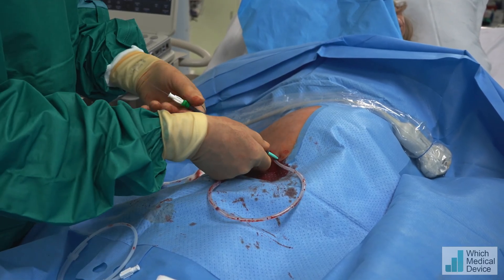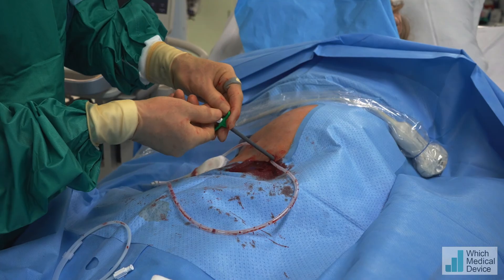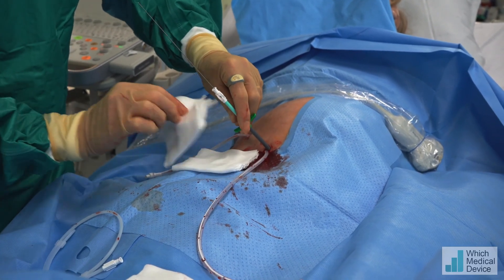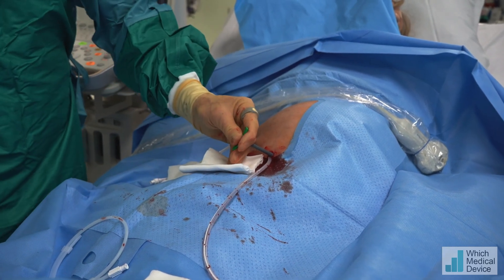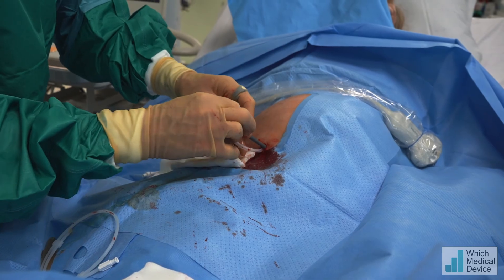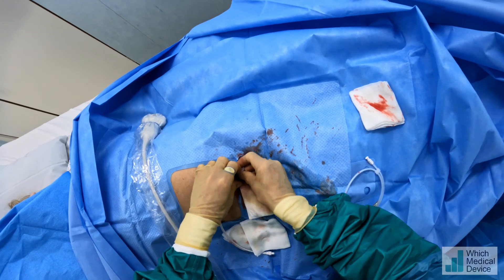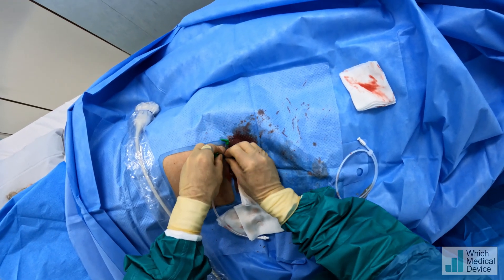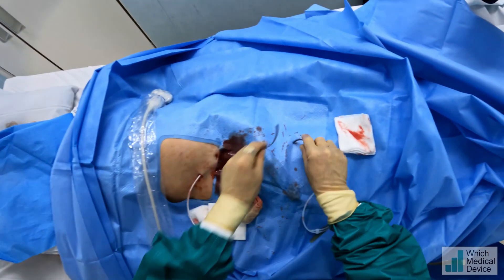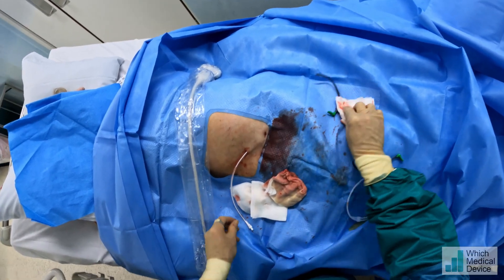There's going to be quite a lot of pushing now — anything too sore, you let me know. I'm just going to rotate it as it goes, keeping the same angle, and I can feel that's in already. I'm just going to hold the central bit on the wire and advance the peel-away a bit further forward very gently. Have plenty of gauze here because there's going to be a lot of leakage of ascites. We're going to take that out and feed the drain in. Once the side holes are in it will stop leaking — the side holes come a long way along this Pleurex drain, which means they're less likely to get blocked. We're now going to peel the peel-away sheath away, keeping forward pressure on it — and that is the Pleurex drain in. Now we need to put a suture in to hold it and pop some dressings on, then drain the fluid off.